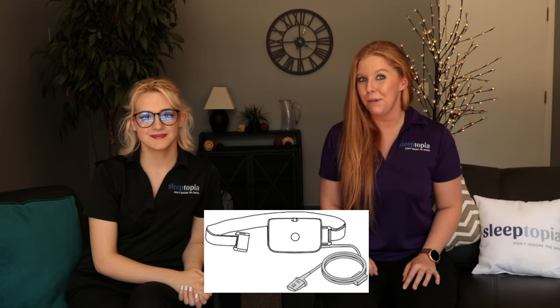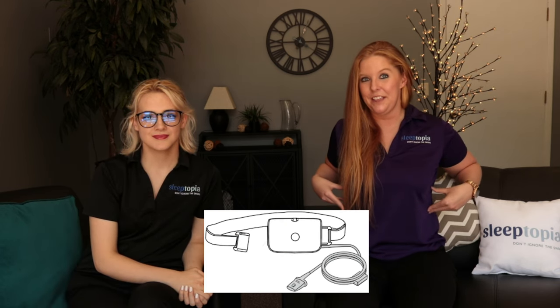Today we are going to be discussing the Alice Night One device, which is another one of the Sleeptopia home sleep devices. This is just a small device that will sit on your sternum, and then you have a belt holding it in place that will measure the effort you're putting into your breathing. There is an SpO2 probe that will monitor your oxygen levels in your blood through the night, and this device will be placed on the tip of your finger. Finally, there's the nasal cannula — nothing is coming out of it, it is simply measuring your breathing and snoring.